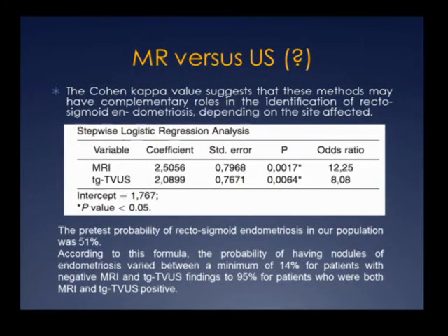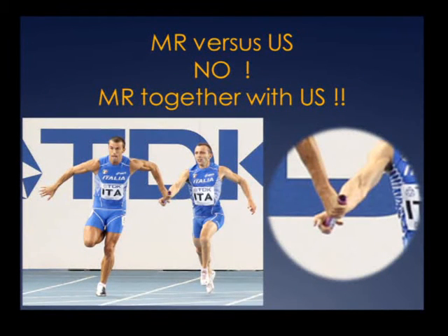because we obtain that in using both techniques, we increase the effect of these two. It's a complementary effect. We increase additional effect in terms of results. And for this, we use both techniques usually, because I think it's not MRI against transvaginal ultrasonography, but probably increase the capability of both techniques to obtain a good diagnosis.